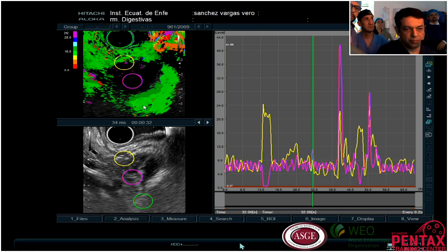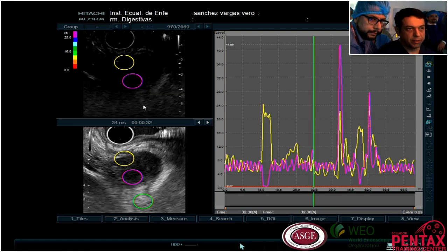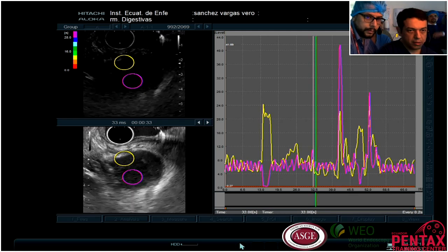Dependiendo de la curva donde estemos, en el momento, eso se puede diferenciar, entonces va cambiando de color. It will depend on the time and the frame. Podemos analizar de pronto esa que está en el pico.